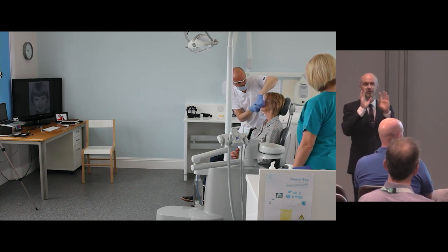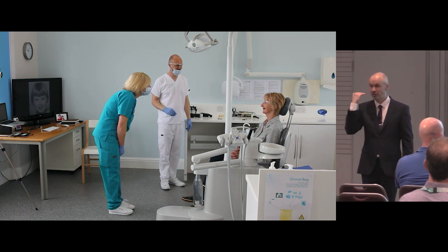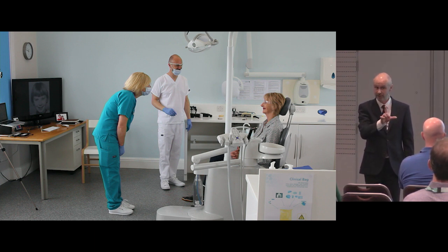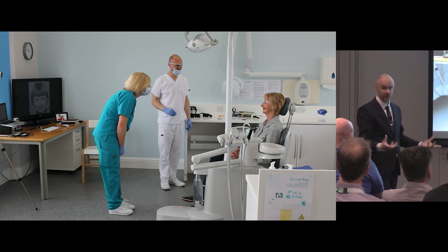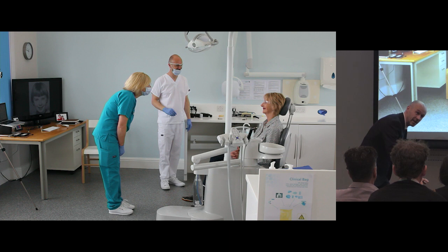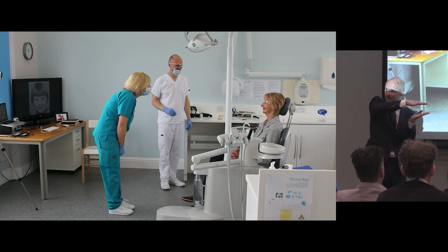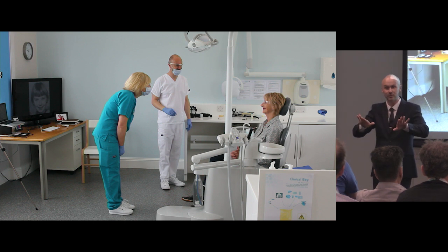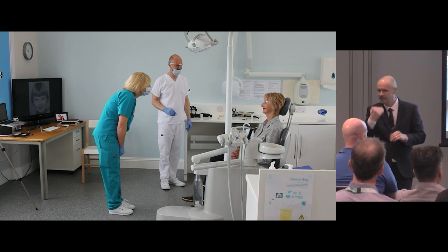It's a very simple order that I do. Number 1, I carve the lip support first. Number 2, the incisal plane second, with reference to the photo, very much so. Thirdly, trim the occlusal plane parallel to the ala tragus. Because if we all dried our heads, took our mandibles off and put our heads on the bench, our occlusal plane would be within literally a degree of Camper's plane, that ala tragus. So it's anatomically correct, and it makes the dentures look terrific if we trim the occlusal plane properly using a Fox's bite plane. That helps to produce that lovely curve following the lower lip. So that's 3.